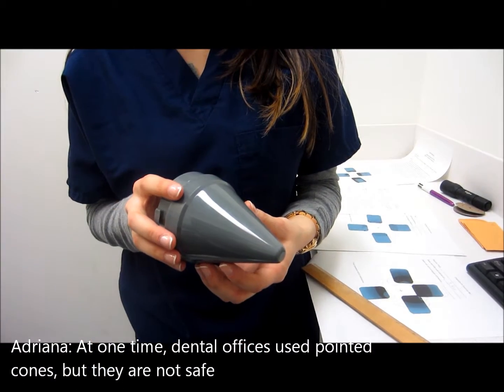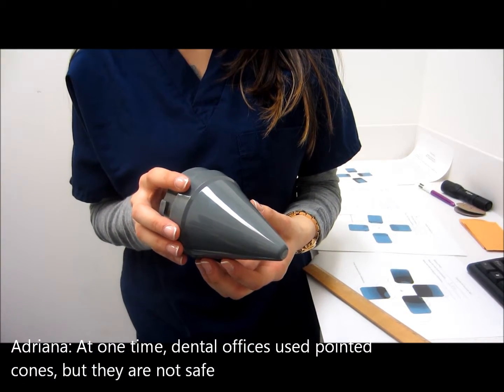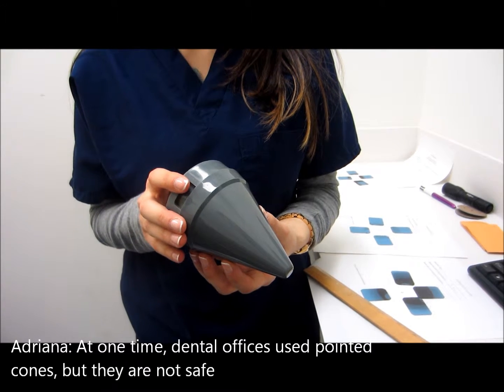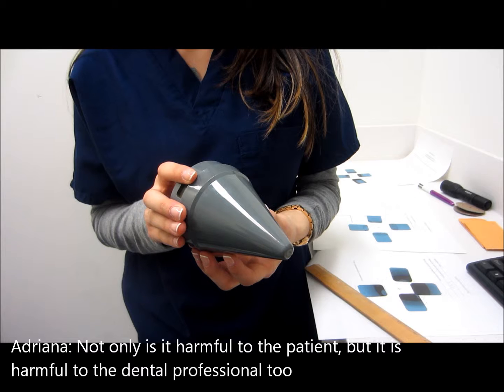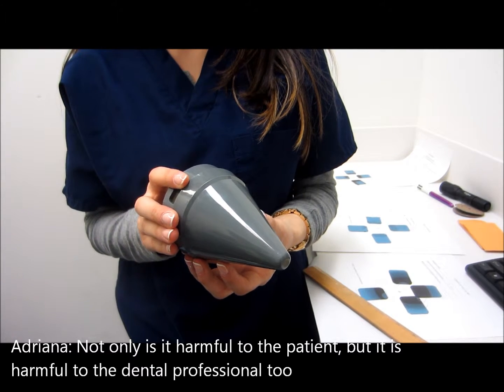At one time, dental offices used pointed cones, but they are not safe. The primary beam collides with the plastic and produces scatter radiation. Not only is it harmful to the patient, but it's harmful to the dental professional too.